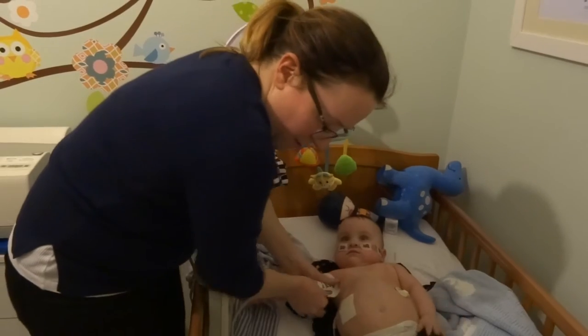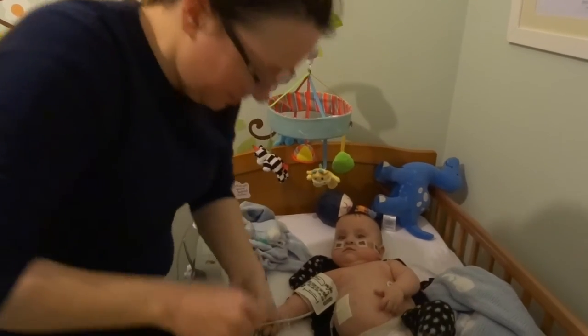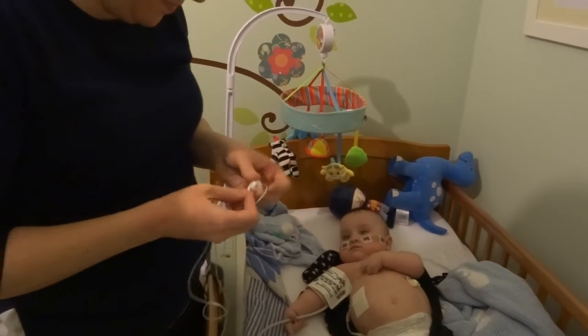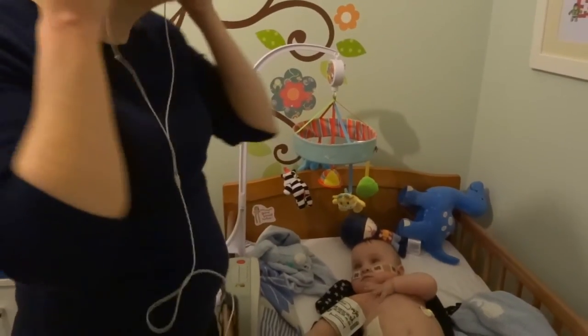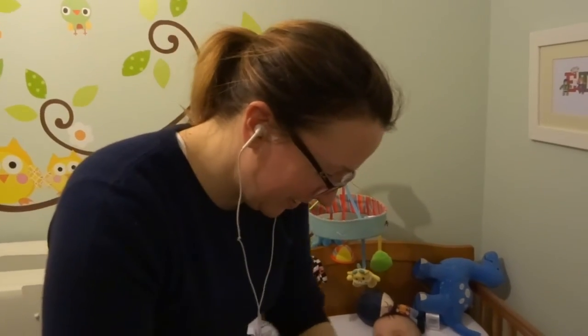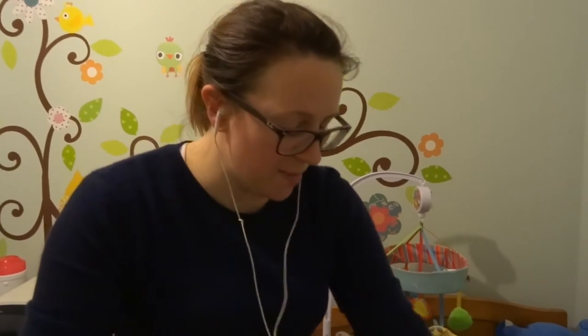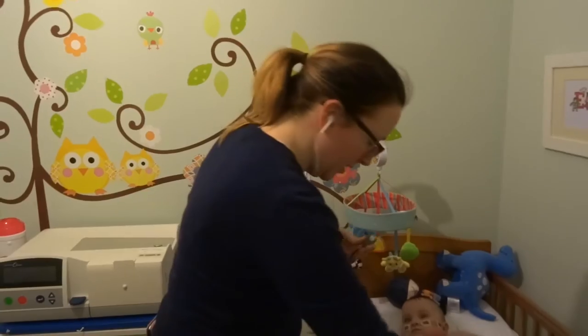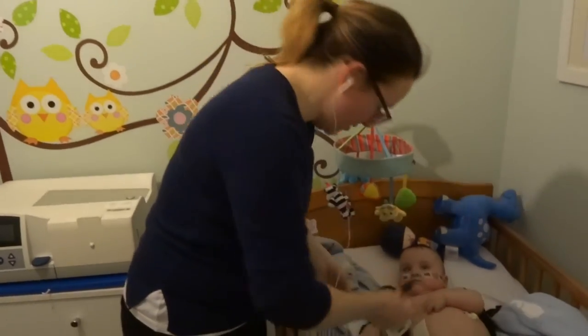Let's put the cuff around there and put the headphones on. Just like when you have an ultrasound and they put that funny gel on — I'll put that gel on here too so we can hear Ethan's heart rate.